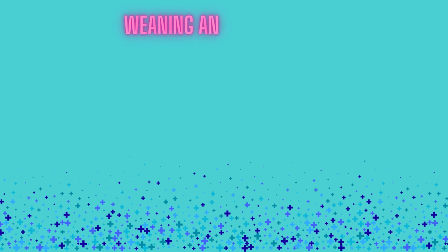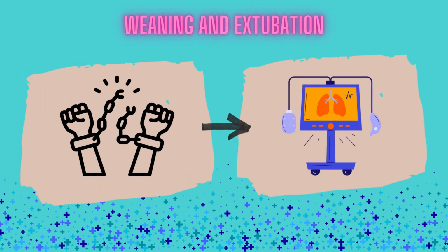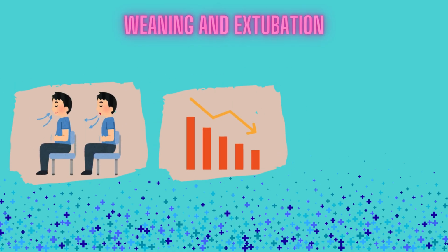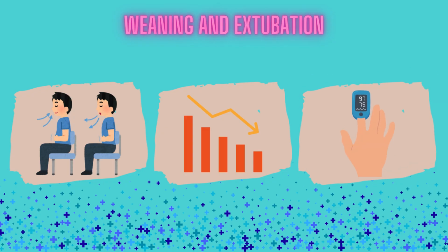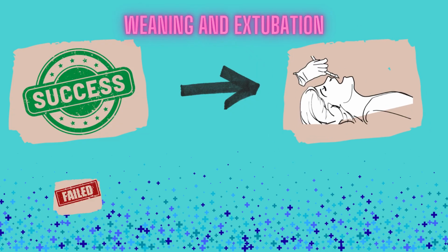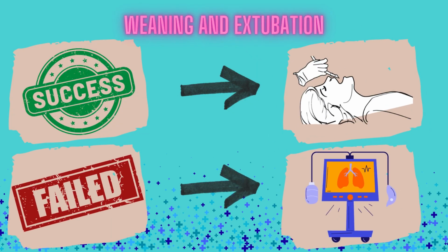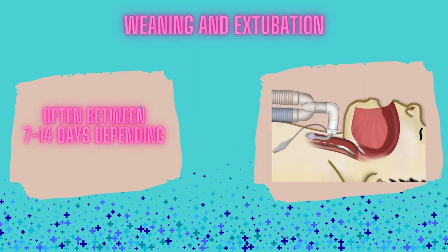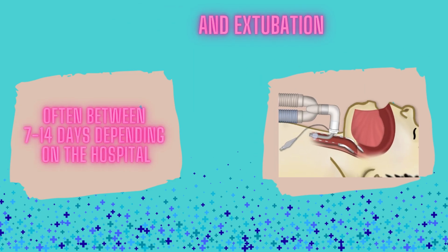The ultimate goal is to liberate the patient from the ventilator. Once the underlying issue improves, the team assesses readiness to wean. This may include spontaneous breathing trials, gradual reduction in support, and monitoring for fatigue or desaturation. If successful, the patient is extubated. If not, support continues until they're stronger. In cases of prolonged ventilation, a tracheostomy may be considered.